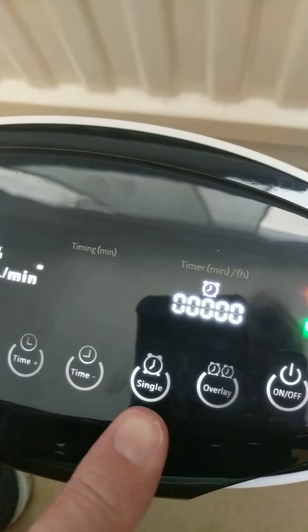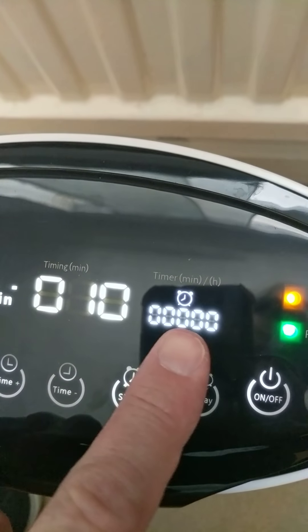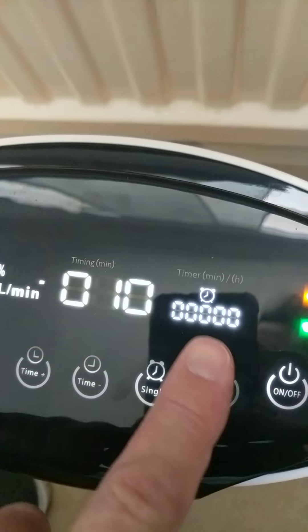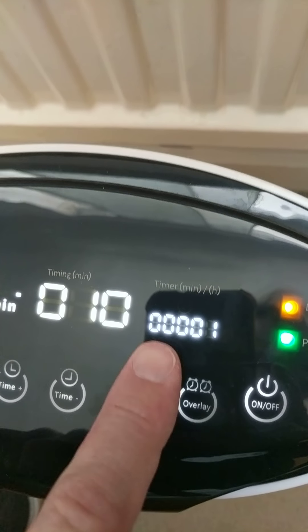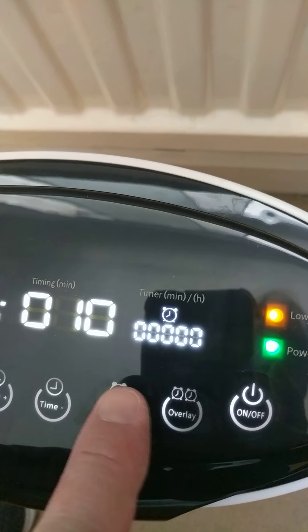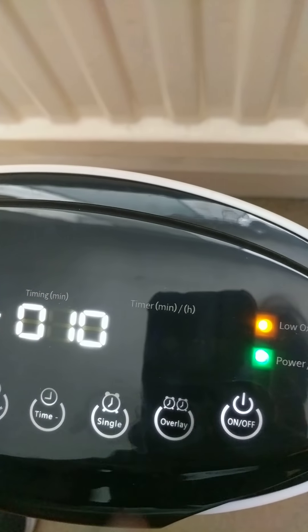Now this is a bit of a mystery: single and overlay. I think this timer tells you how long the unit's been on for, so this will increment to one maybe — or maybe this is what does it. Single — no idea. And then there's this overlay button. Single, overlay — or just turn it off. I really haven't got a clue what these buttons do.